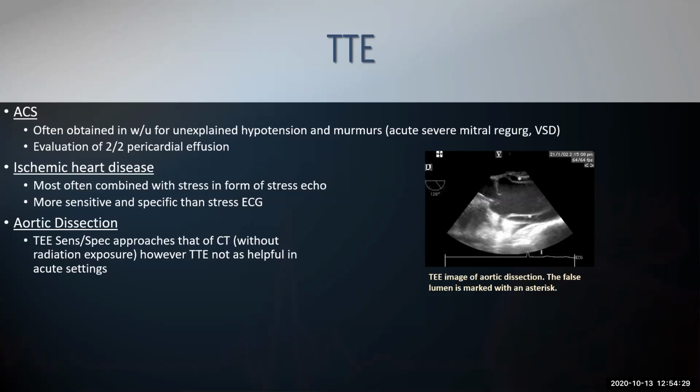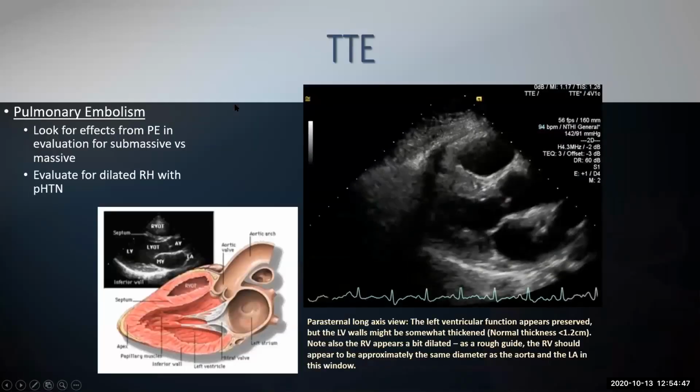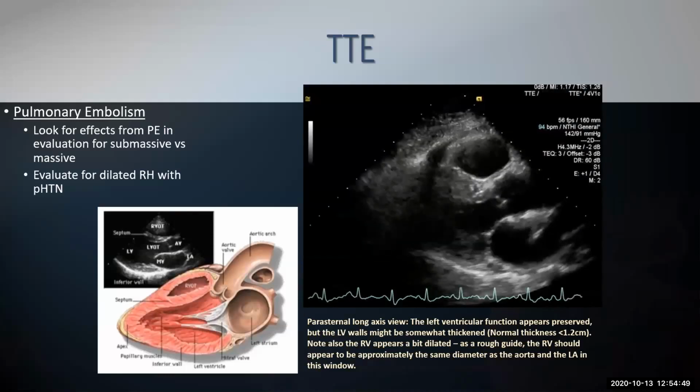The TEE is clearly going to be more specific and sensitive for that, but it's very invasive, obviously. So the TTE is something you can do at the bedside. This is just a summary of all the different views that I put in one slide with the anatomy. I'm not going to go through each one of these, but just for you guys to have when I send this out. Here are some echoes that I put in.